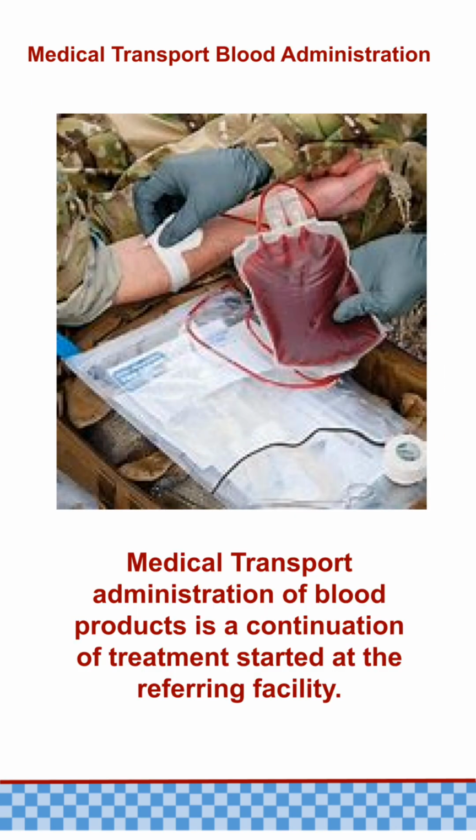During the medical transport with administration of blood products, you are not starting the initial administration. During the medical transport call, you will be continuing the administration of the blood product that was initiated by the referring facility. The primary reason for transporting a patient with blood products being administered is to get them to the next level of care without the delay created by waiting for blood administration to finish before transport.